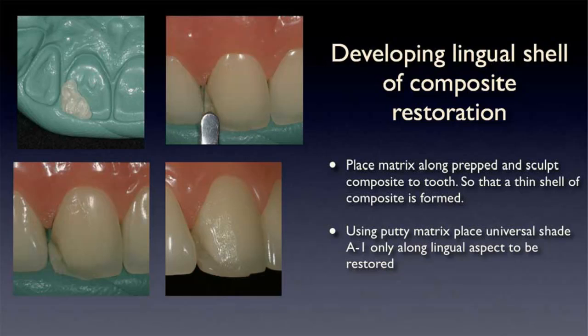Why don't I etch the dentin? You can etch the dentin. Certainly you can etch the dentin if you want to. It's just that with the all-in-one types of bonding, it's a self-etching type of adhesive, so you don't need to over-etch the dentin. So certainly, but if you feel much more comfortable etching dentin, feel free to do so.